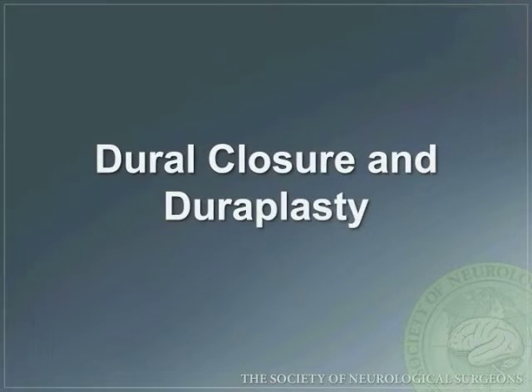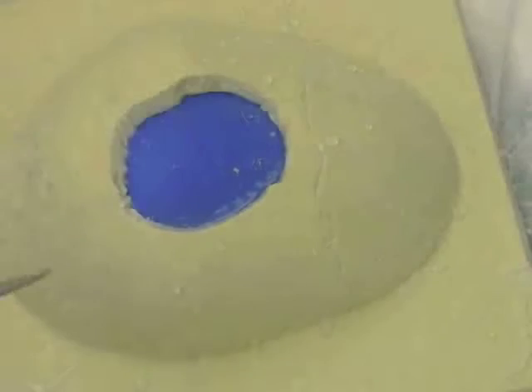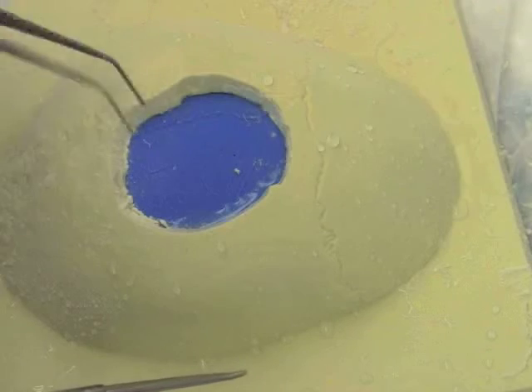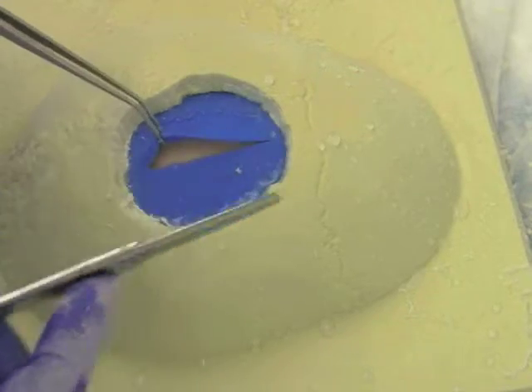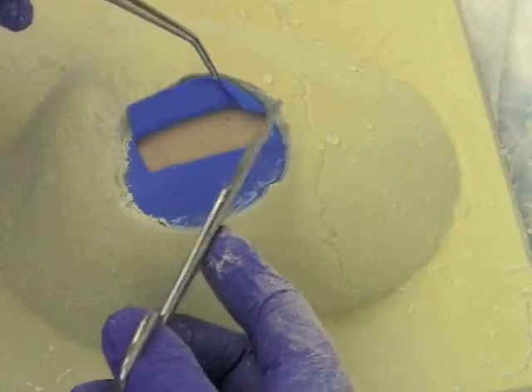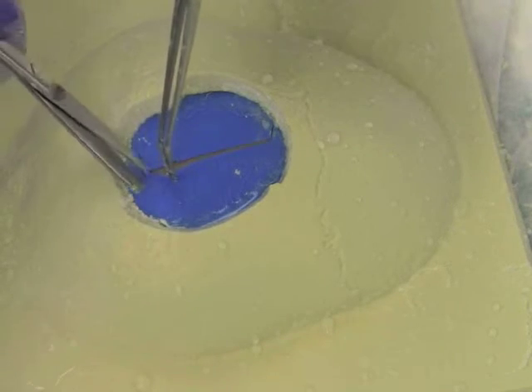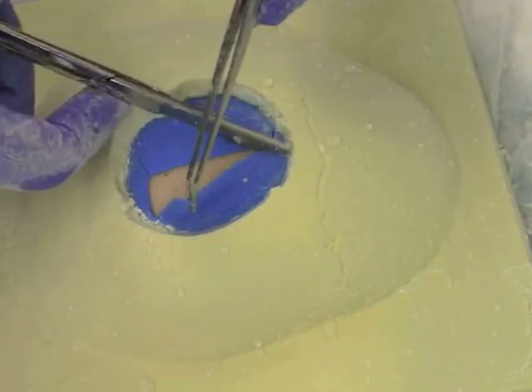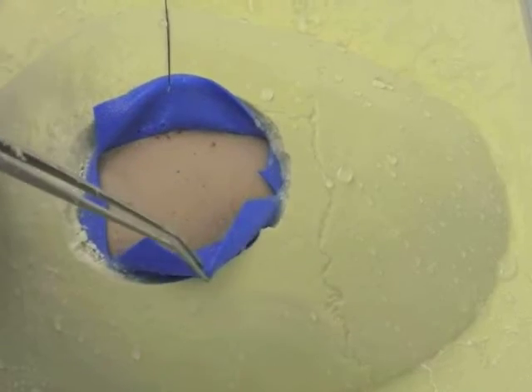When opening the dura, caution must be used to not injure the underlying cortical surface. An initial cut is carefully made to expose the cortex, and the dura is elevated to visualize the underlying cortical structures. The scissors are then carefully used to open the dura, constantly visualizing the cortical surface and elevating the scissor tips away from the surface to prevent any unwanted injury. In order to increase exposure and maintain visibility, dural tack-up stitches are used.